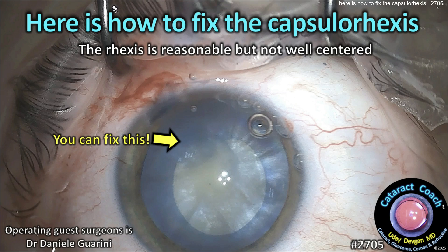Cataractcoach.com. Here's how to fix the capsulorhexis. This is a reasonable capsulorhexis but it's not really well centered and it's a little bit on the small side. Let's see how to fix it.